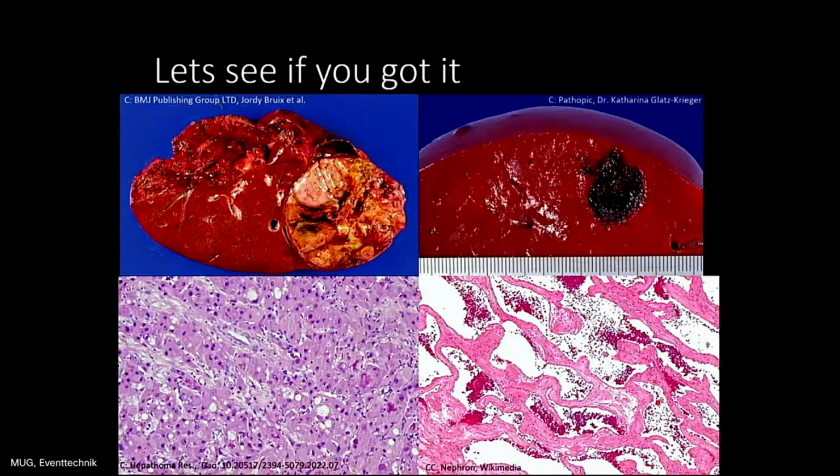So if we go back to histology, in the hemangioma we see there is a lot of impedance steps. You have connective tissue, you have liquid, connective tissue, a lot of impedance steps. And that's what creates an echo. That's why this hyperechoic lesion is most likely to be a hemangioma. While in the hepatocellular carcinoma, you have quite continuous tissue, and it's not so different to liver tissue itself, seen from an impedance perspective.